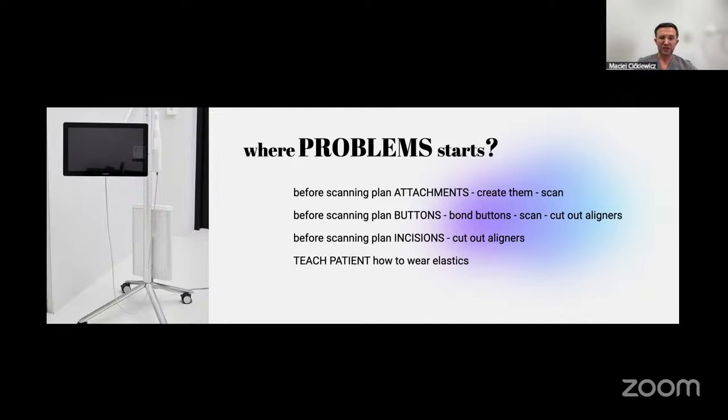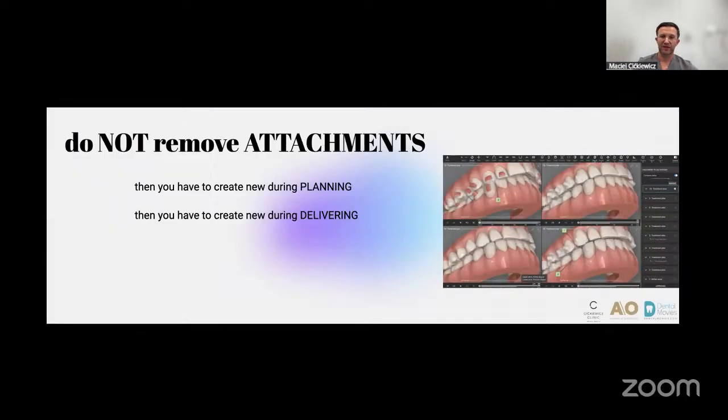And also teach patients how to wear elastics, because sometimes it's a new element of the treatment and the patient doesn't know how to do it. So if you want to speed up, so you don't waste your time on the next segment, you do it on this visit, and then you're saving a lot of time.